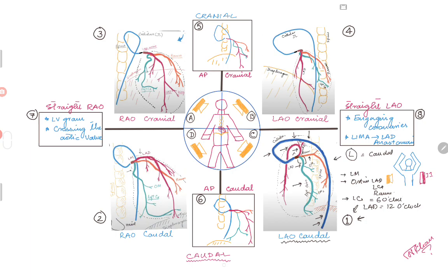This is a good view to look at the proximal portion of the left main, left circumflex, and LAD. It is not a very good view for the distal vessels or distal branching vessels, as they will be overlapped and foreshortened, but nevertheless a very good view for the proximal segment. This view is also known as the spider view.